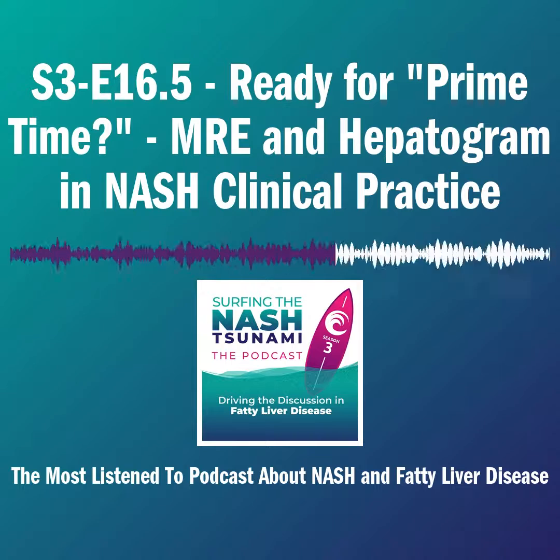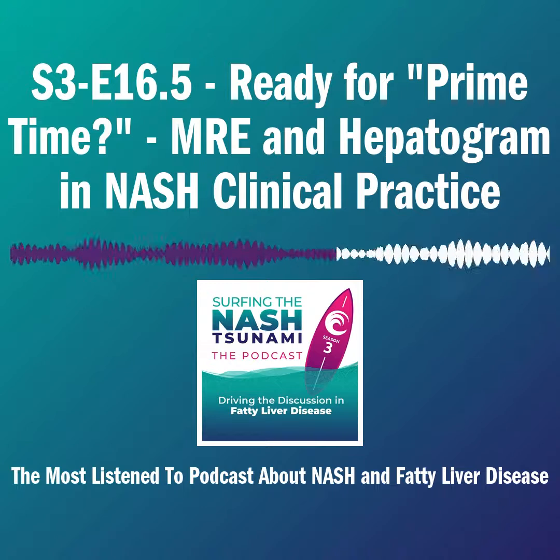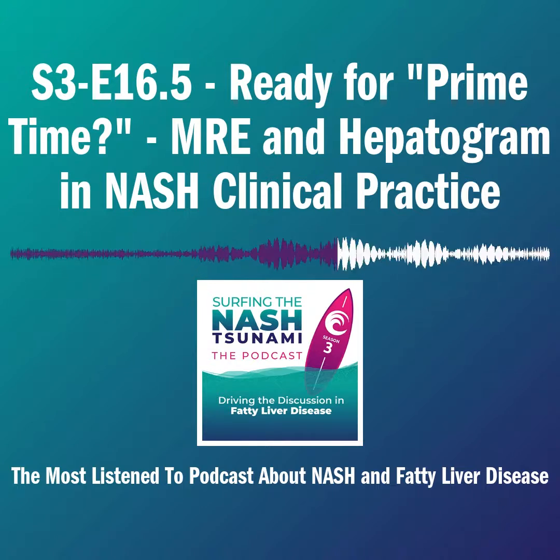That's really where we've already seen studies showing where imaging biomarkers are showing a treatment effect. For example, some of the work that Rohit Lumba has done with PDFF, where you don't see any change with biopsy, it's probably just due to that coefficient of variability.